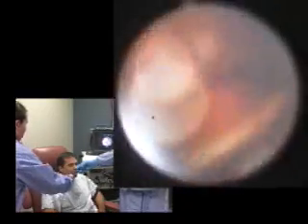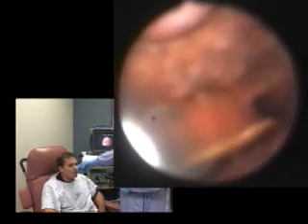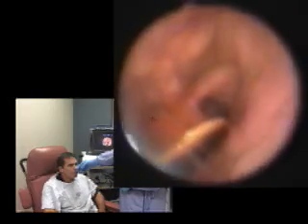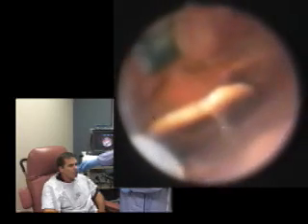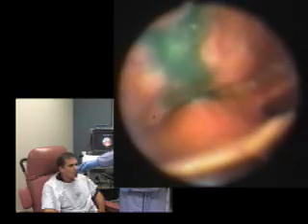So I am now looking at the closure of the oral cavity and its separation from the pharyngeal cavity. You see the uvula just coming into the view, and the tongue base is elevated. The soft palate has touched the posterior tongue. He is losing some colored material coming into the vallicular space, as you see here.